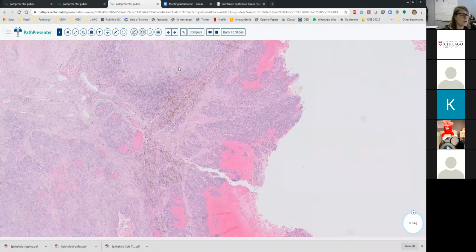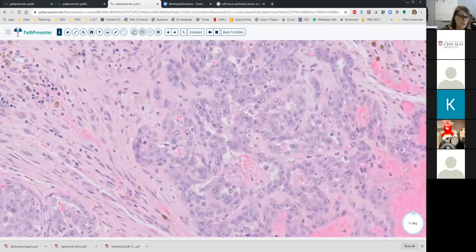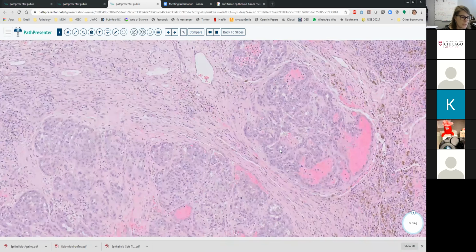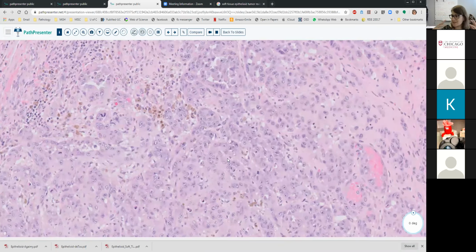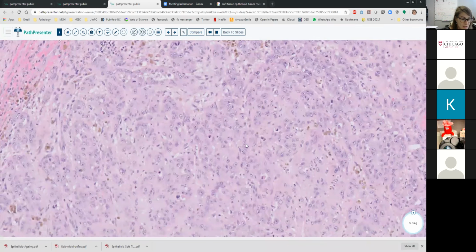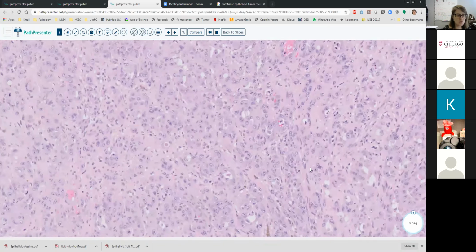Epithelioid angiosarcoma. All right. I think most people who voted got it. So the things to keep in mind with this are, some people said epithelioid sarcoma, melanoma, completely reasonable because of a number of things, including the large size of these cells with the prominent nucleoli, right? But this is a repeating theme in a lot of these epithelioid malignant mesenchymal neoplasms, that they are large, they do have prominent nucleoli, and they sometimes have rhabdoid morphology. I was pointing out a couple of cells with rhabdoid morphology. I don't know if you saw those, but all of these features are so overlapping.